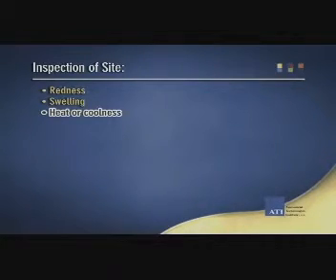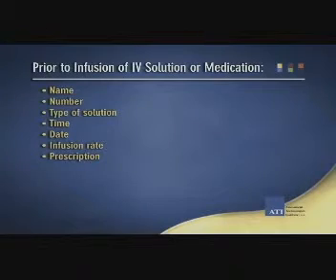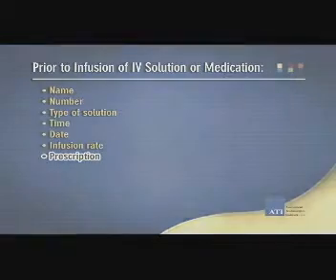Prior to infusion of IV solution or medication, check the information on the label of the container, including the client's name, number, type of solution, time and date of its preparedness, and ordered infusion rate. Compare the label on the infusion or medication with the physician or practitioner's prescription to verify that the solution is the correct one.